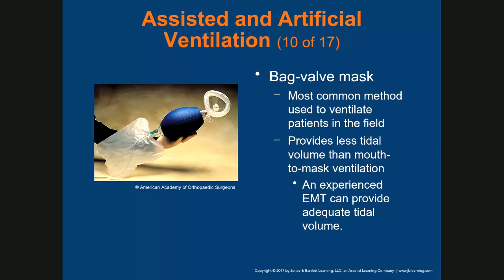Bag valve, the most common method used to ventilate patients in the field, provides less tidal volume than mouth-to-mask ventilation. An experienced EMT can provide adequate tidal volume, and it is a device that will take you some time to get comfortable with. You won't understand what I'm talking about until you have the device in your hand.